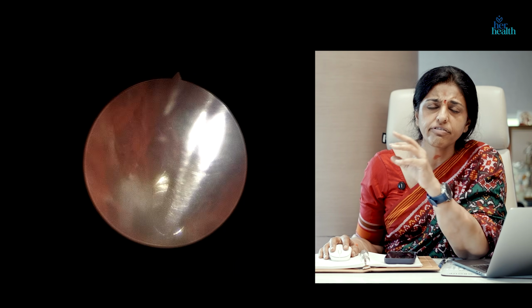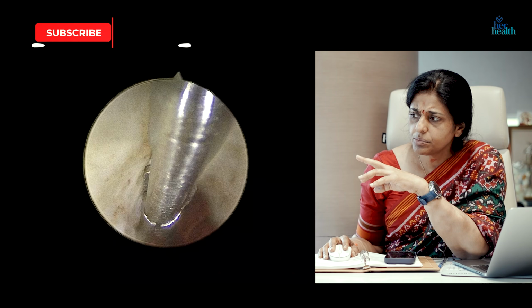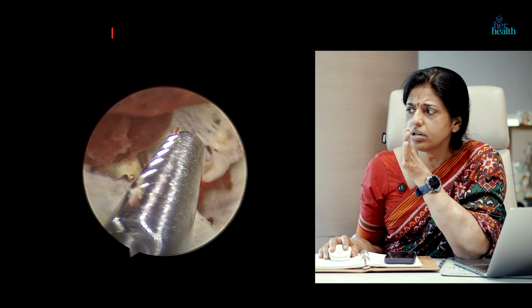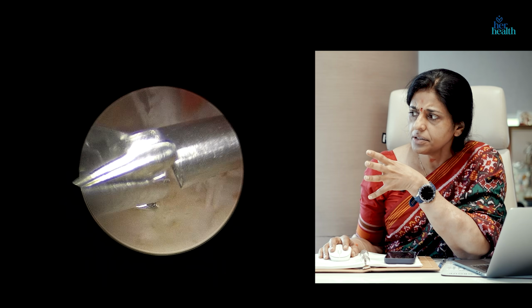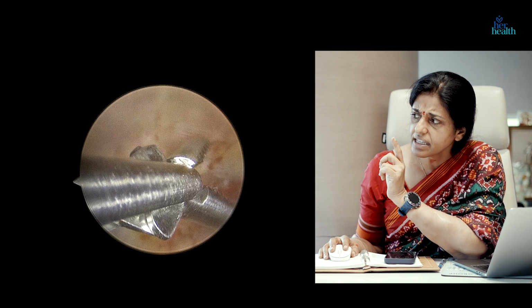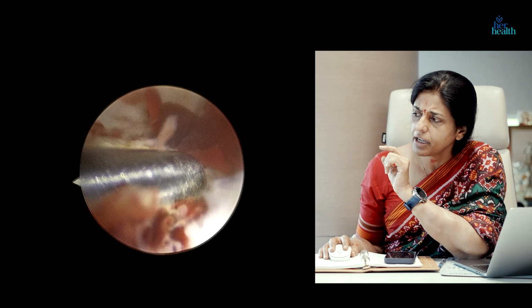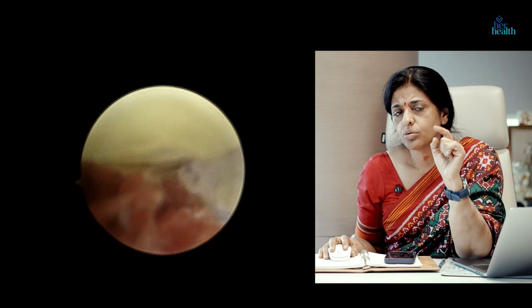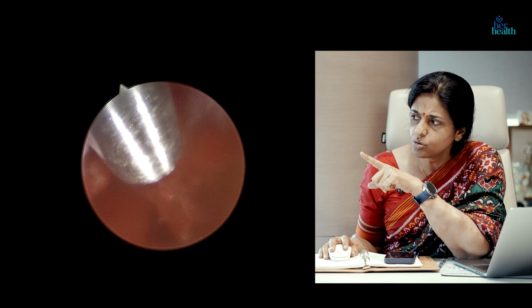The common bones that we find are flat lamellar bones. Sometimes we do find ribs, and we are removing the second bit of bone. Sometimes some part of this bone may be densely adherent or be inside the cavity. This is one such situation where part of the bone is inside the myometrium. So first we try and insinuate and remove it from the myometrium, then grasp it properly and then pull it out. As we are pulling it out, make sure to remove the inflow. And so this another second bit unfortunately is left behind in the cervical canal. I'll go for it again.